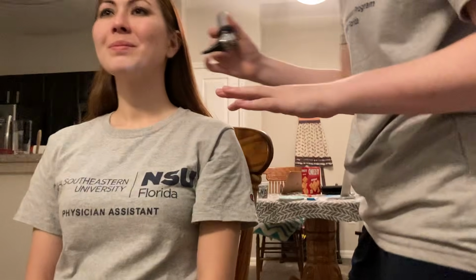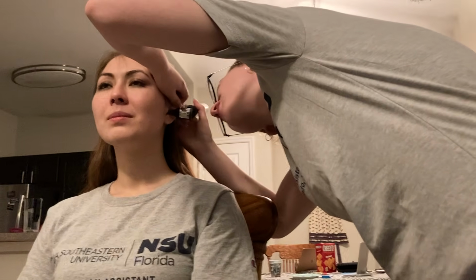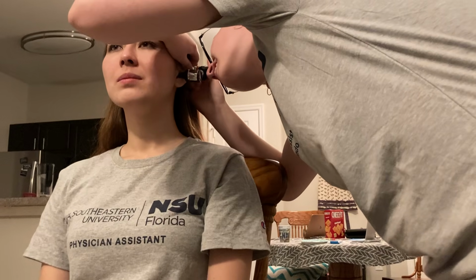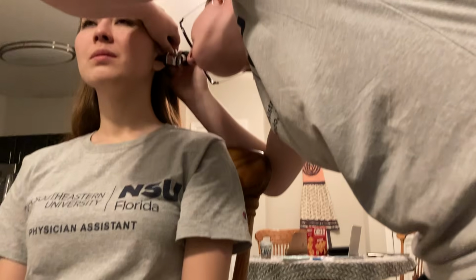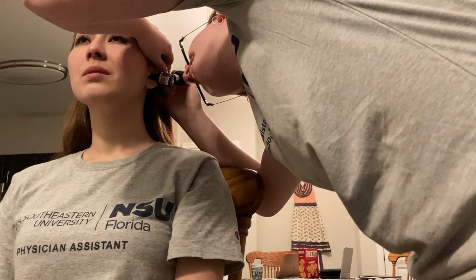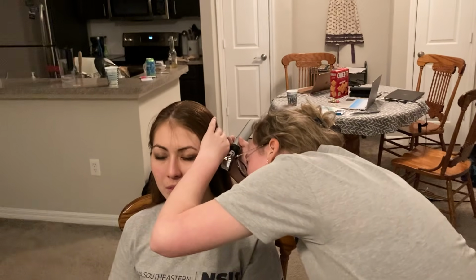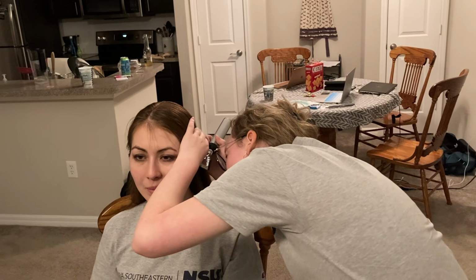Okay, same thing. Again, if you have any discomfort, just let me know, okay? Okay, so I'm inserting. And you see again the external canal is unoccluded. And I see that tympanic membrane again is pearly gray and translucent. I see the light reflex. That is going to be antero-inferior again. I see the malleus, I see the umbo, pars tensa, pars flaccida, and they are also undistorted.